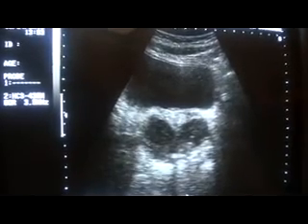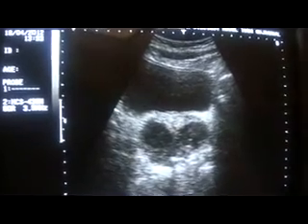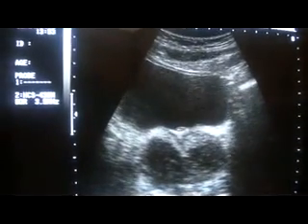Once again, right in this direction, 25 millimeters into 28 millimeters. Right one is 26 millimeters.